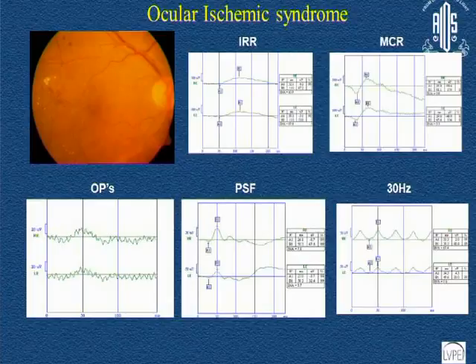One is that you can see there is almost a bald retina. There is no NPDR, hardly any NPDR. You would expect in a CSME patient to have at least some microaneurysms, some hemorrhage, some NPDR, on the background of which the CSME occurs. So there was nothing, that was all completely empty. And the other was this vein. This vein was really dilated, tortuous, a single vein, focal lesion. So then you start thinking about what is happening.